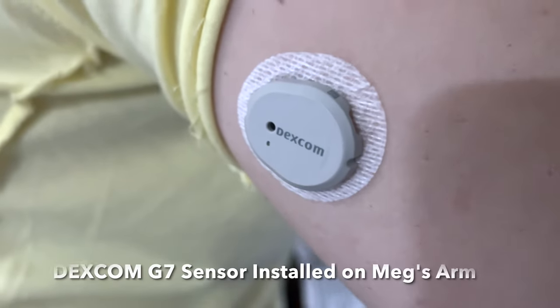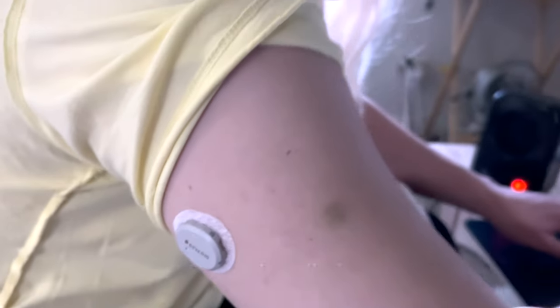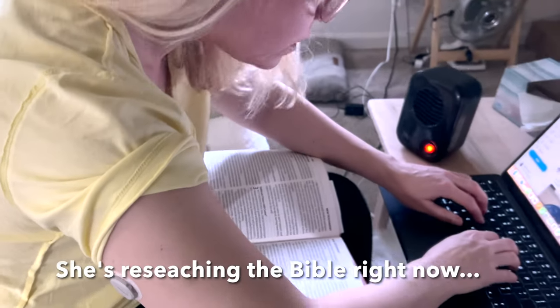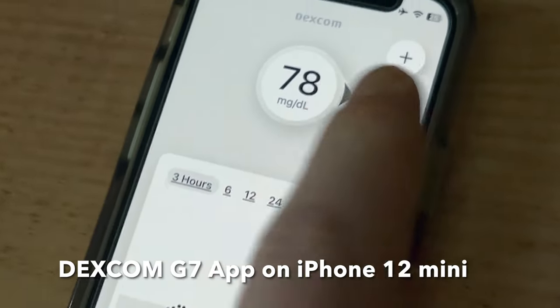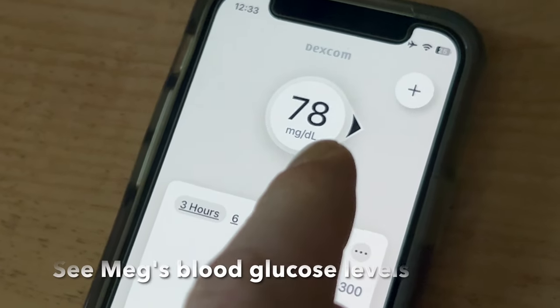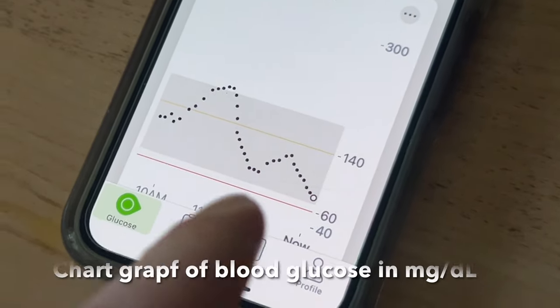That is a Dexcom G7 sensor installed on Meg's arm. She's researching the Bible right now. So that's the Dexcom app and we can see that Meg's blood glucose is 78 milligrams per deciliter, and this is the chart now over time.